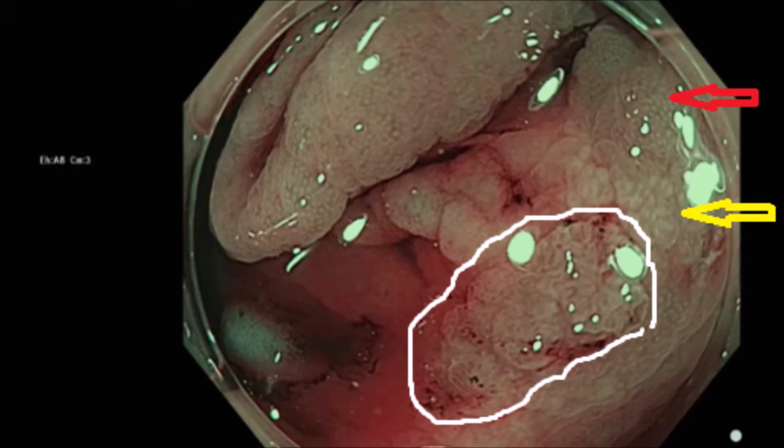And when we're evaluating these EMR scars, we need to be able to distinguish the non-neoplastic changes, which could be normal in the case of type 3 clip artifact, could be inflammatory with type 1 or 2 in the base of the scar, and distinguish both of those from the neoplastic changes, the residual adenoma that we need to treat.